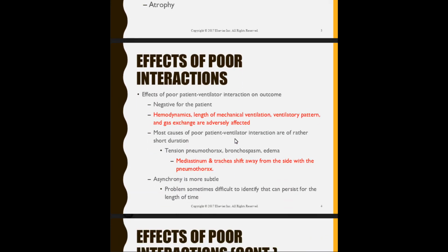Okay. Effects of poor interactions. Most of the time, poor interactions come out to be negative for the patient. Patient is suffering. So if you wanted to go to lunch, you wanted to go to breakfast, you got to get that last piece of toast, that last piece of fish, right? Or you have someone cooking something, you're like, wow, that's a lot of good grub, and you got to get there. So you just put the patient on whatever settings, and then you go take off. Well, guess what? You're hurting the patient because they're not interacting with the ventilator in a more harmonious or synchronous state.